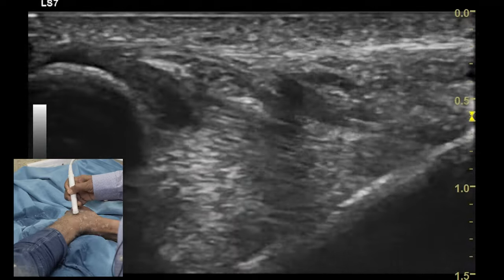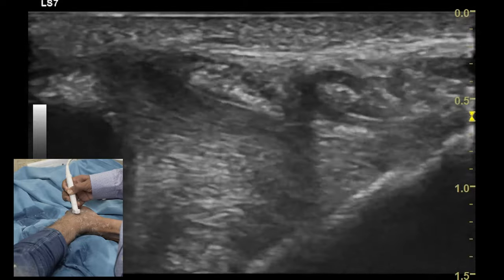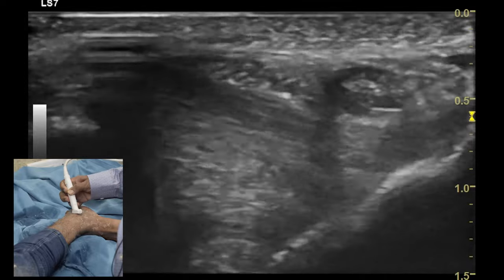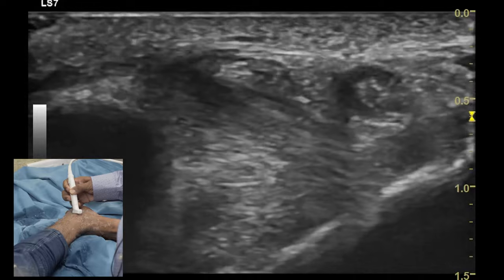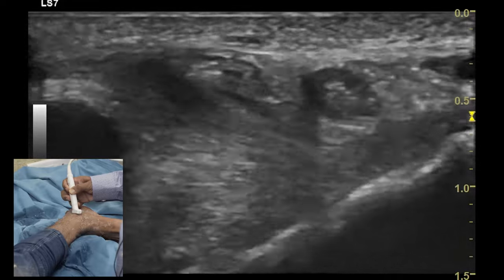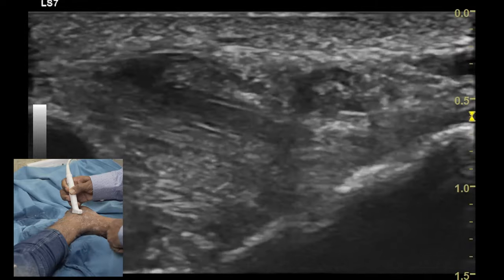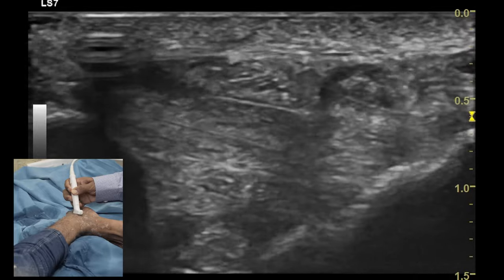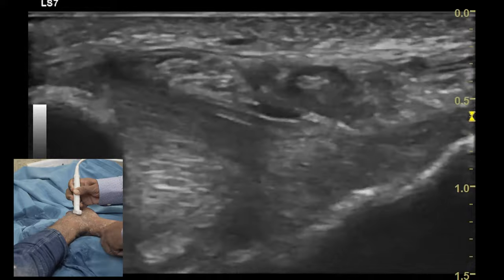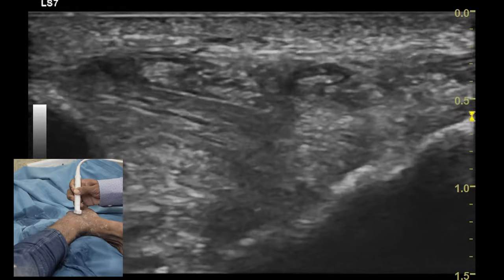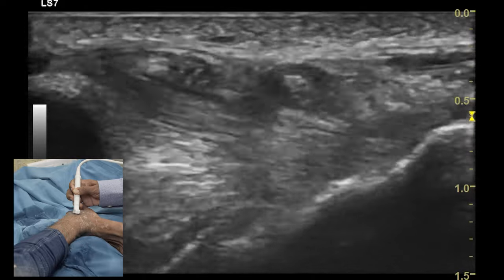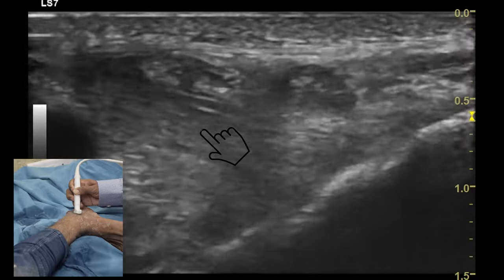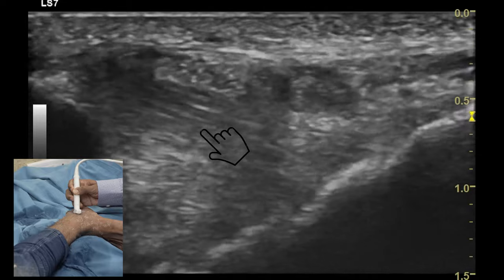Ligaments on the medial aspect of the ankle consist of the deltoid ligament, which has three components: the tibiotalar component, the tibial calcaneal component, and the tibial navicular component. The tibiotalar component can be identified most prominently because of its significant fat content within the fibers of the ligament. By asking the patient to do dorsiflexion and connecting the medial malleolus and the talus, you can see a fan-shaped structure that is the posterior tibiotalar ligament.